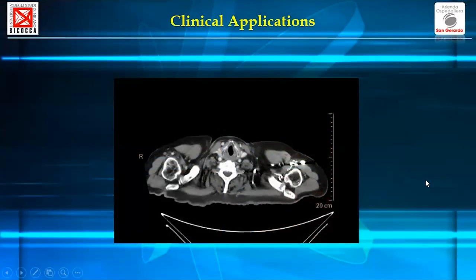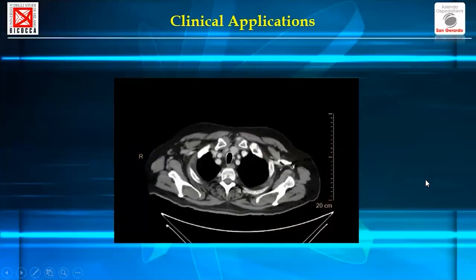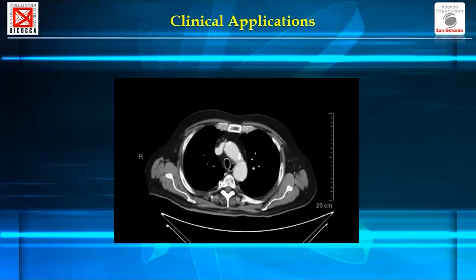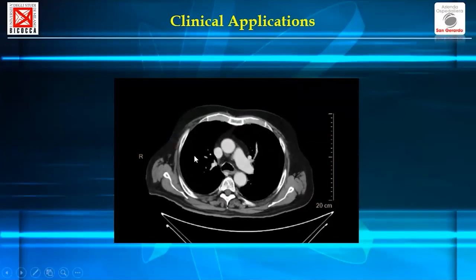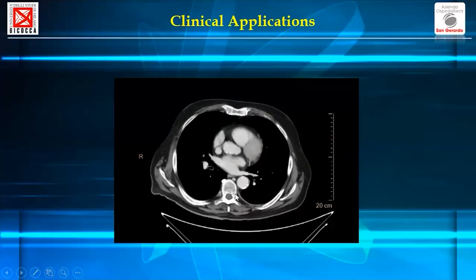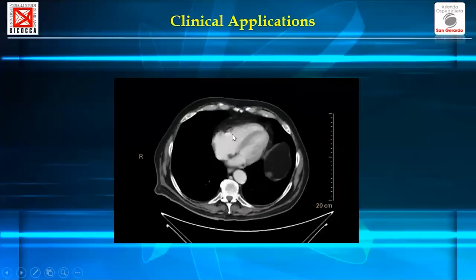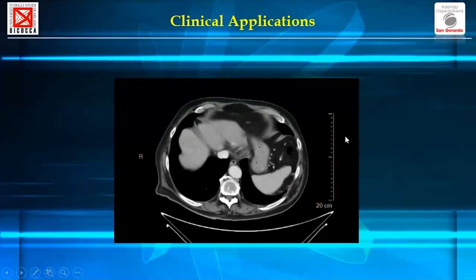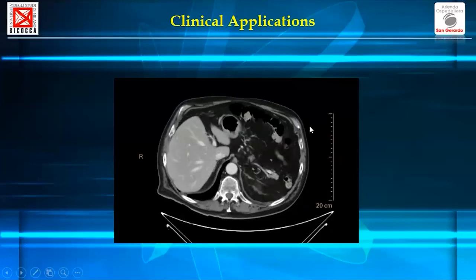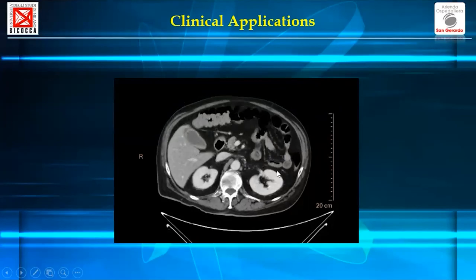And let's move to another example of a patient with rectal cancer, a typical follow-up with only portal venous phase after 3 months of the treatment. In this set of images, we do not recognize any nodular lesion, no fluid in the pleural space, no lymph nodes in the mediastinum, no cardiac alteration or pericardial fluid, no spleen or focal liver lesion, no pancreatic alteration, homogeneous enhancement of both kidneys.